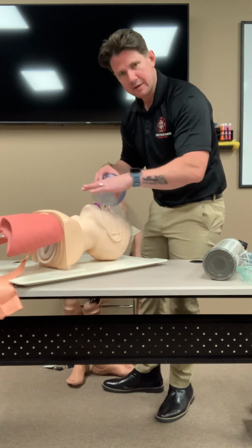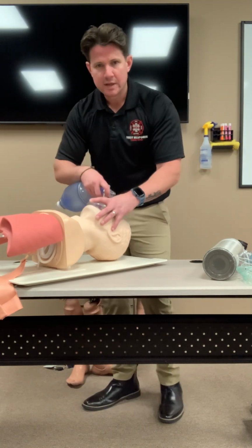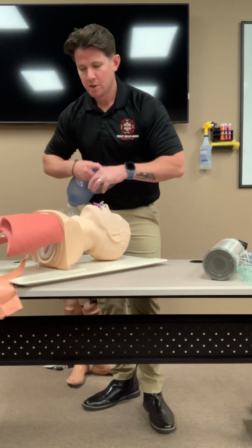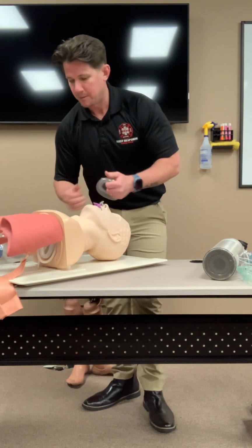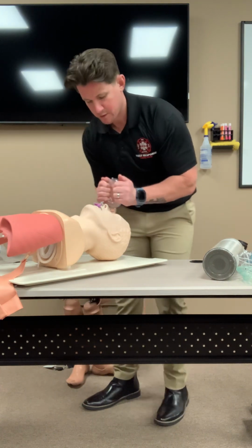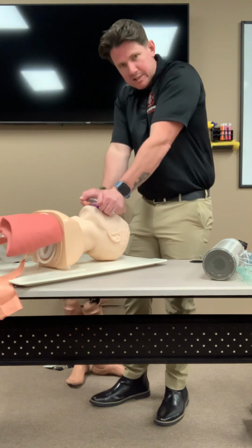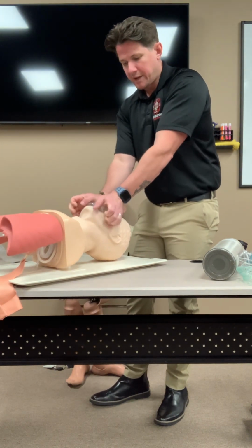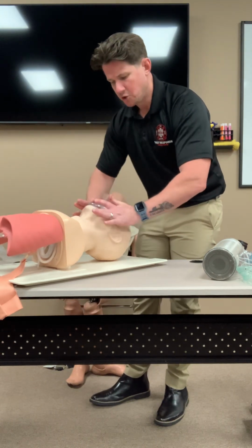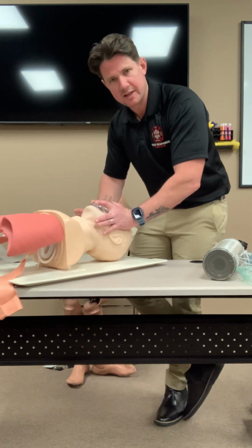So once you've verbalized everything you know about bagging and what we're doing, if we introduce a second rescuer, what I want you guys to do is say, I'm going to use that second rescuer to assist me in two-person ventilation. I am going to direct my rescuer to take the BVM mask and pull it apart. Put the tip of the mask at the line of the pupils. Roll it down the patient's face. Pull out his fingers. It's going to create a suction. Then I'm going to advise him to create the mask seal with both hands. You can use the double CE technique. If you want to, you can verbalize you're going to use the double CE. That is just fine.